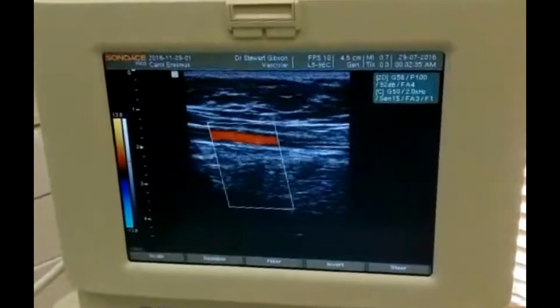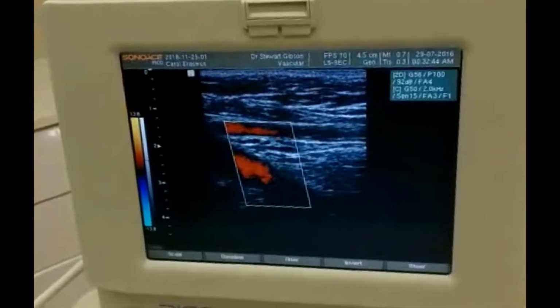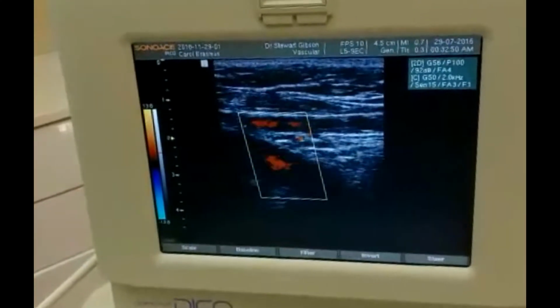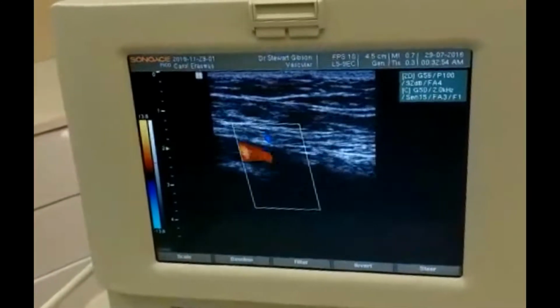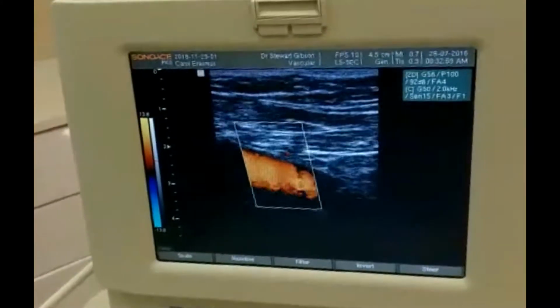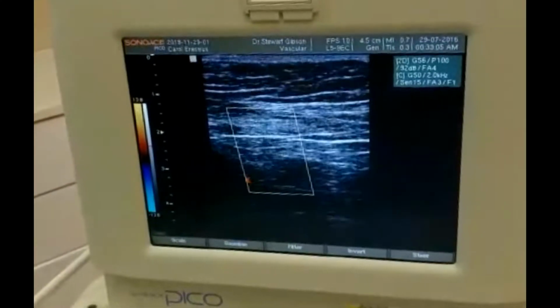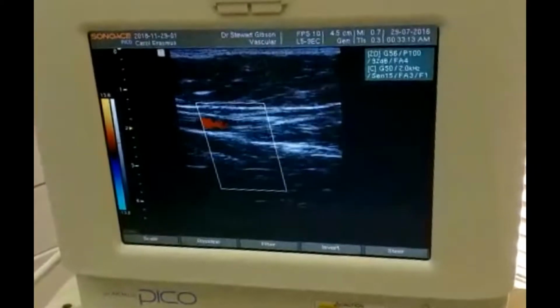going caudally, looking at the complex over here, it's not easy to see whether we do have a connection between an arteriole and the vein, which could be explaining the high venous return. But what we do notice is that the deep venous return is very high as it plunges deep into the medial aspect of the thigh. We are following the great saphenous vein down the leg.